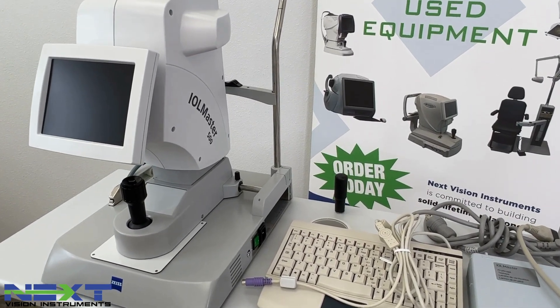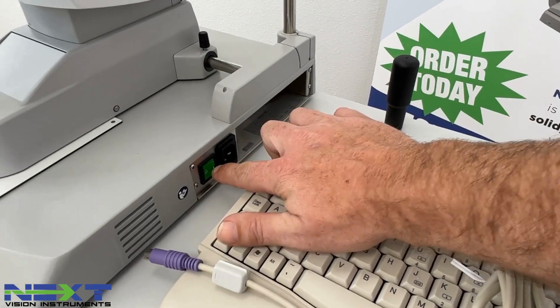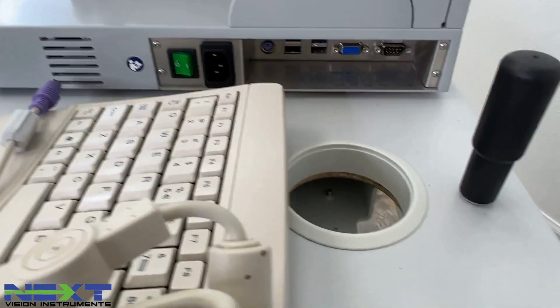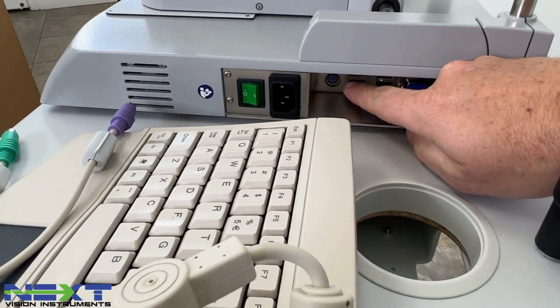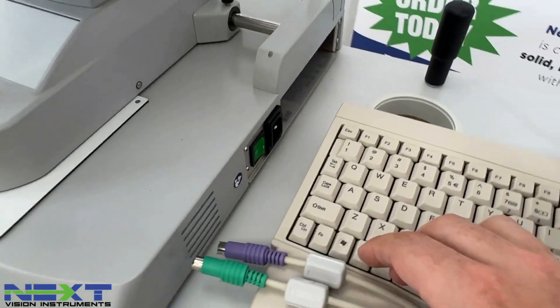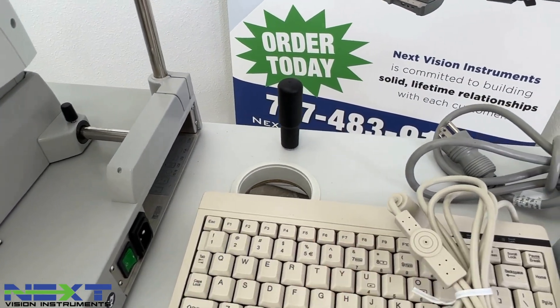On the operator's right side, you'll notice a green power button — this is where the unit gets power. There will be some connectors here. There's a purple one and a green one above it. You'll notice the keyboard is color coded, so we'll plug those into the correct ports.